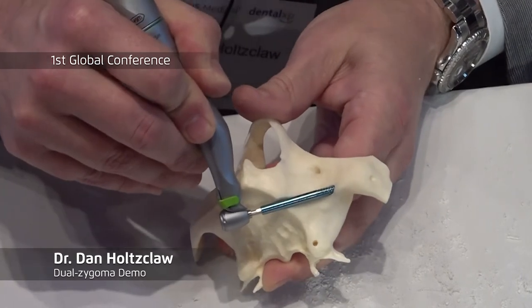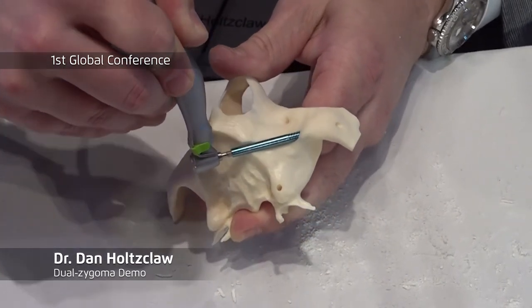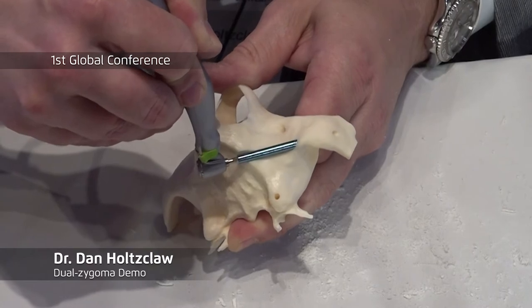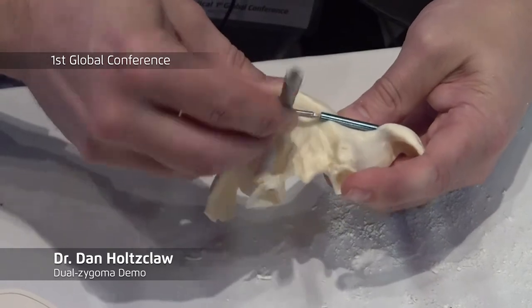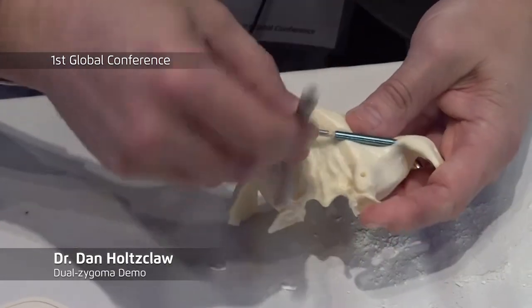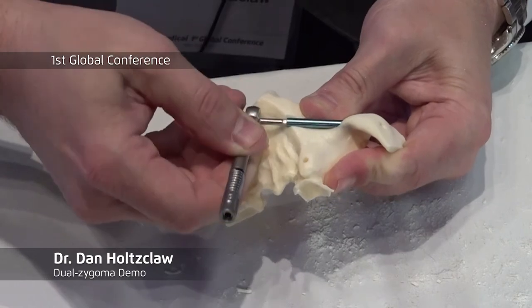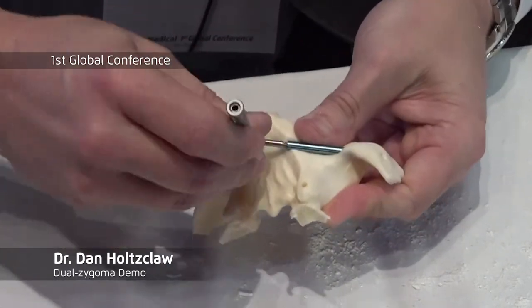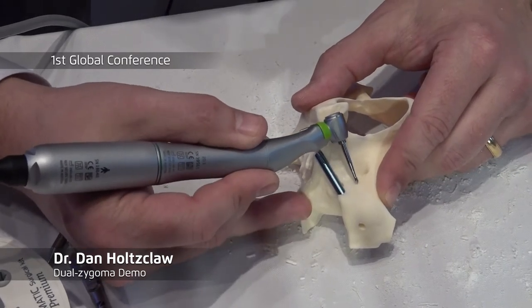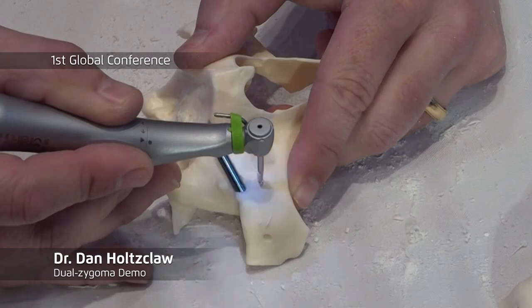Now anything that goes in here — the channel is all the same — so all I have to do is make sure I'm hugging the bone and everything will follow the same channel, because everything has been the same diameter. As I place this, for any of the implants you go in and out, in and out, to allow the bone to expand. I move about an average of six millimeters or so, follow the same direction, and now I can make a purchase point.